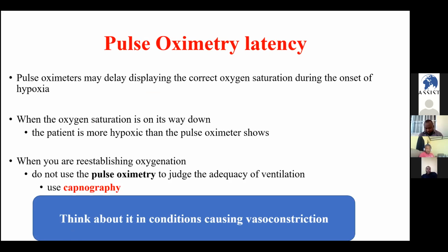Now we are going to see one of the other objectives of our session, which is understanding pulse oximetry latency or lag. This is a situation where you are using these digital probes for recording the saturation and the pulse using the pulse oximeters.